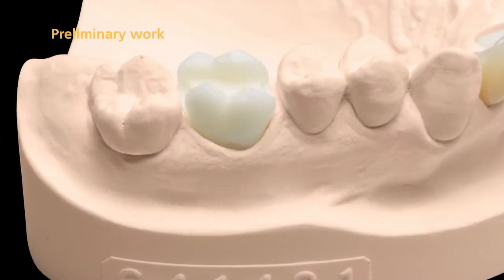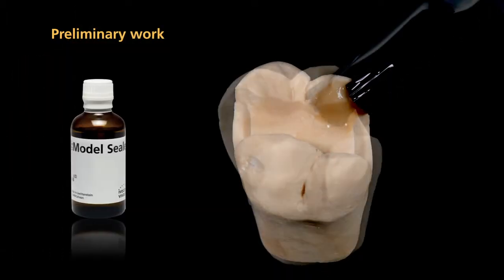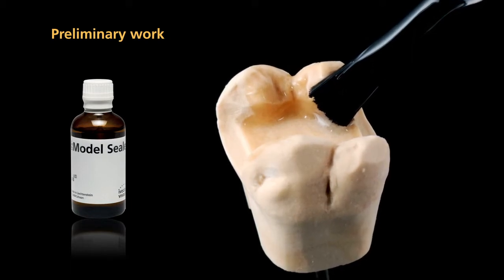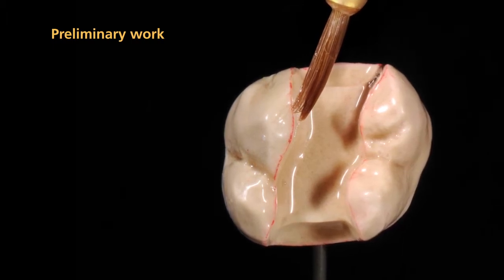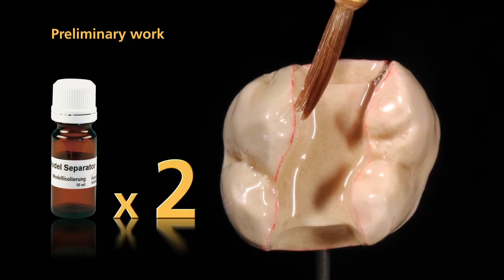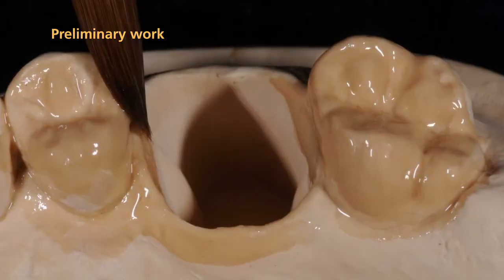First, fabricate a working model with a detachable die as a working basis. It is recommended that you apply model sealer to treat the surface and protect the die. Next, the dies and adjoining parts of the model are sealed. Apply SR model separator in two coatings, making sure that all areas of the die are well covered. Please also isolate the adjoining model surfaces.